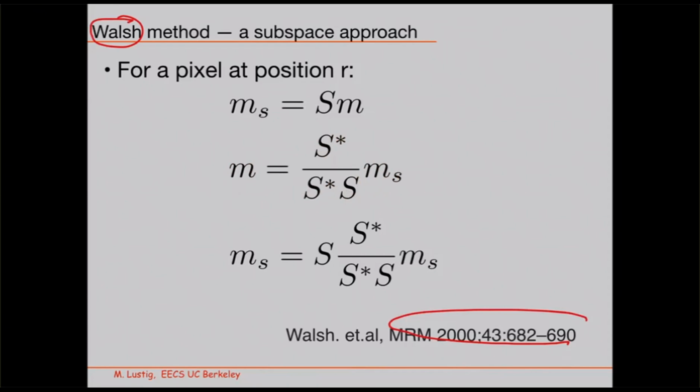This is how I'm going to take these and combine them using the regular coil combination from the Roemer paper that we described last time. This is the square sum of the coil sensitivities, S conjugate S, and on top, S conjugate times M. Remember? That's from last time. This is the regular one. Okay, so multiplying the image with this will give me the combined image, a single image.